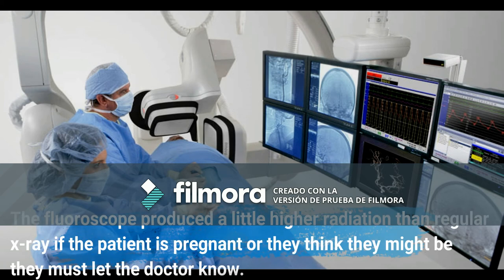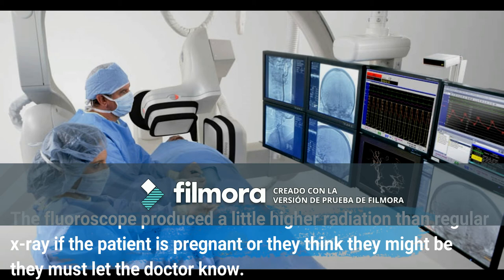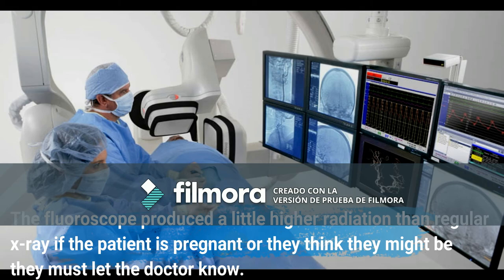The fluoroscope produces slightly higher radiation than regular x-rays. If the patient is pregnant, or thinks they might be, they must let the doctor know.